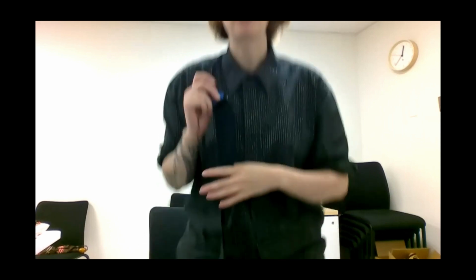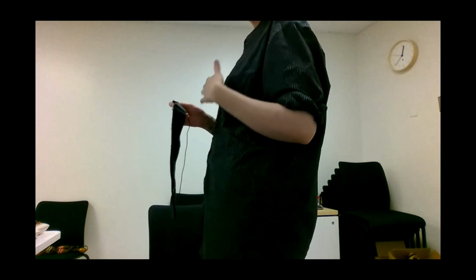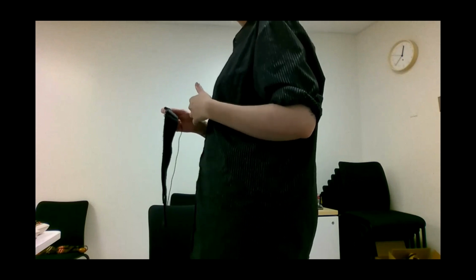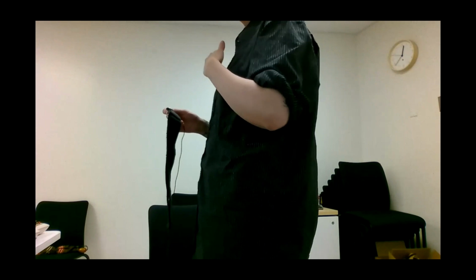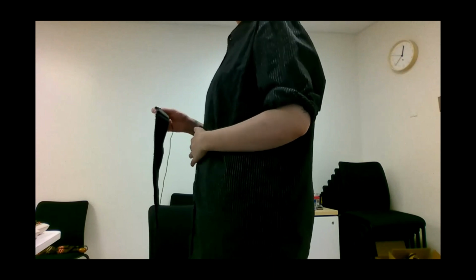When you're setting up the belt, you want to be really sensitive to changes in that circumference. So you're going to ask your participant to take a deep breath. I'm going to exaggerate this, but what you want to do is look at where the biggest changes are happening during their breathing. If they're breathing more from their upper chest, a breath might look something like this. So we have this change here, versus if they're breathing from lower in their abdomen, you'll see changes more around their diaphragm like this.